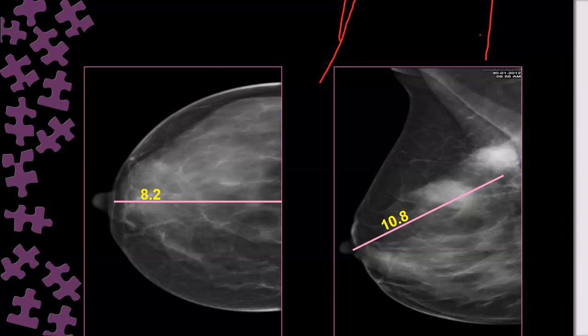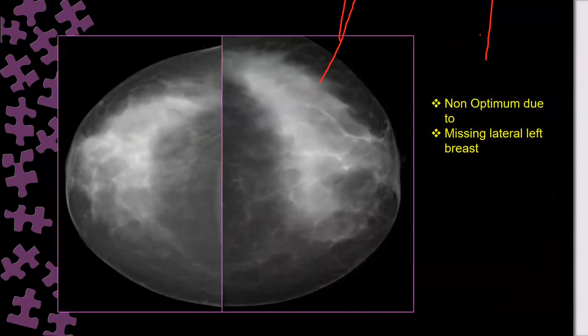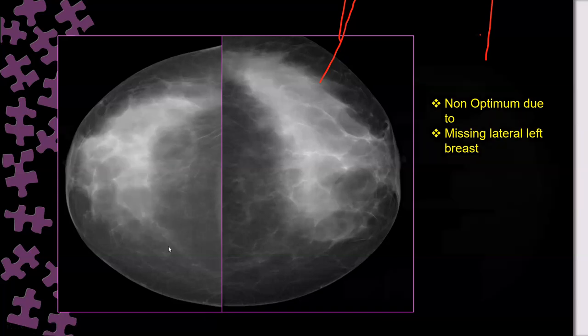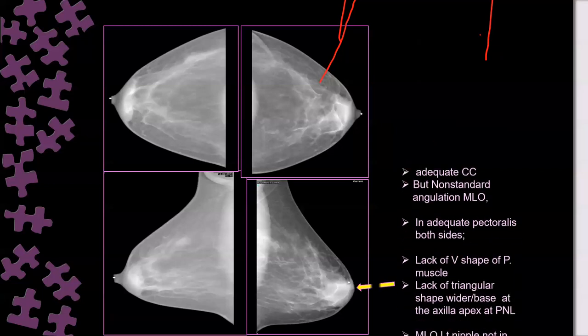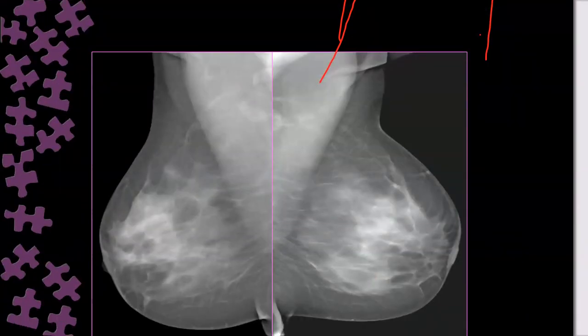If you see the posterior end of the parenchyma very narrow, going toward narrowing, let me show you where. It starts to become narrow, like here, for example. At the end it tapers and becomes narrow, then you can be a little bit relaxed. But when you see it very wide, ending in abundant, thick parenchyma, you expect still much more posterior parenchyma, more than 1 centimeter. So you will not be relaxed in this case. Without measuring the posterior nipple line, you will not be relaxed. There is a mismatch here. What about this one?